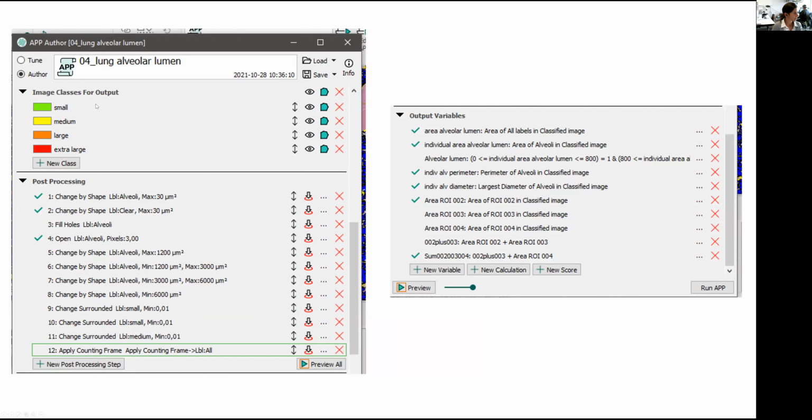And of course, I can quite individually decide what I want. Do I want to classify certain values into scorings and make them visible? This will create kind of heat maps on the slides. That's quite nice to illustrate patterns of lesions sometimes. And of course, again, I can turn on and turn off things that I want to include or exclude.